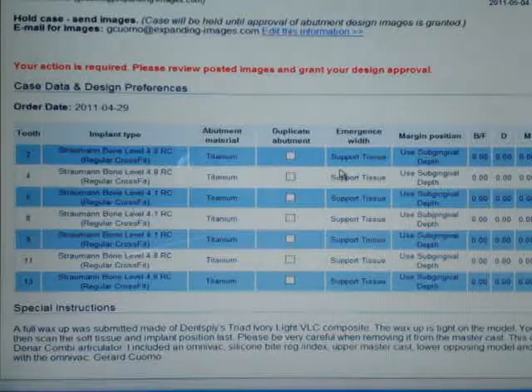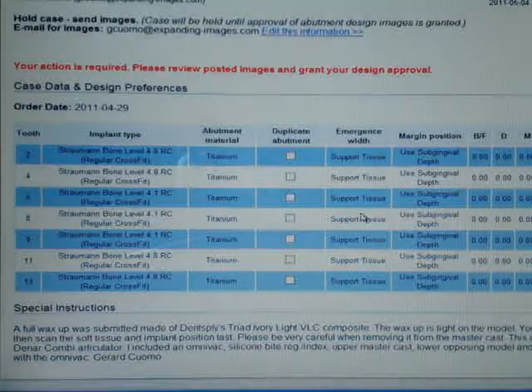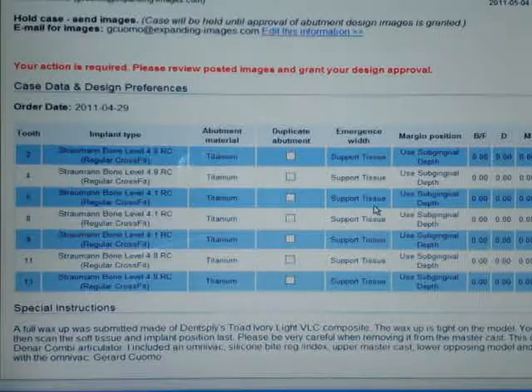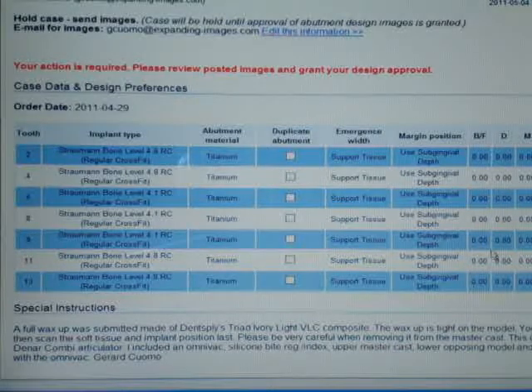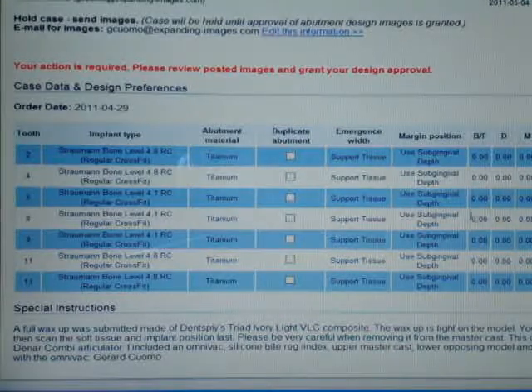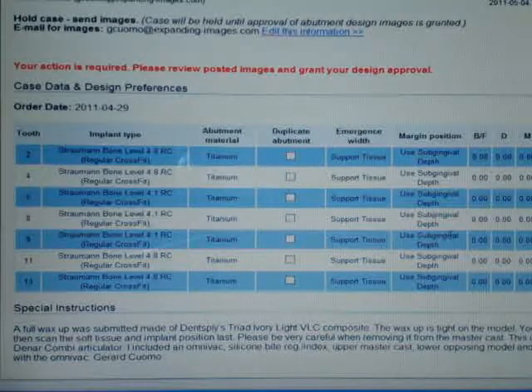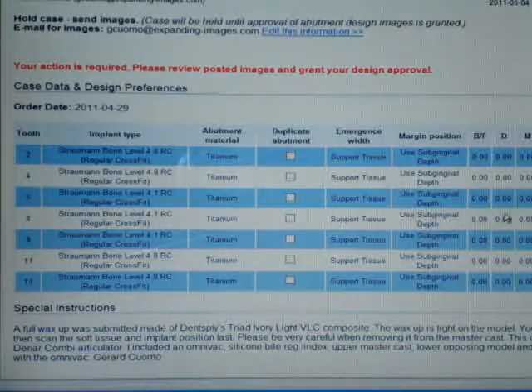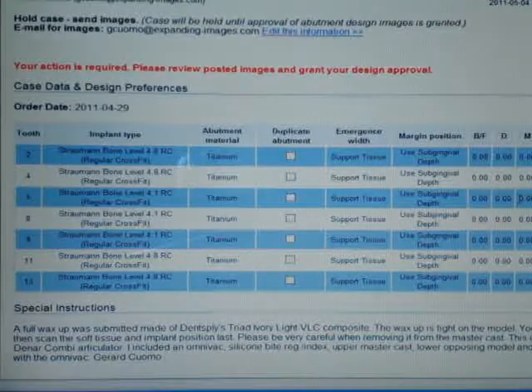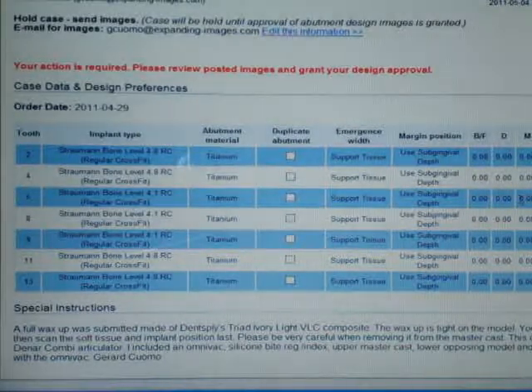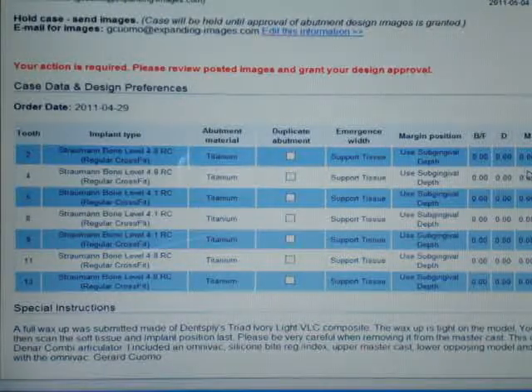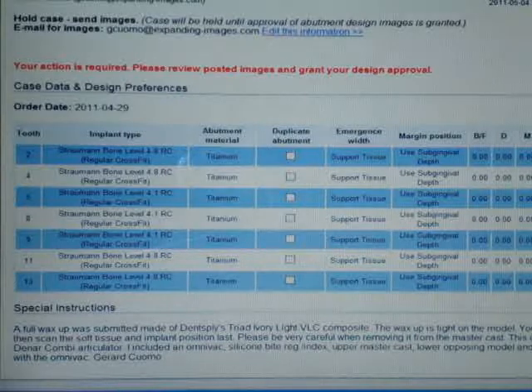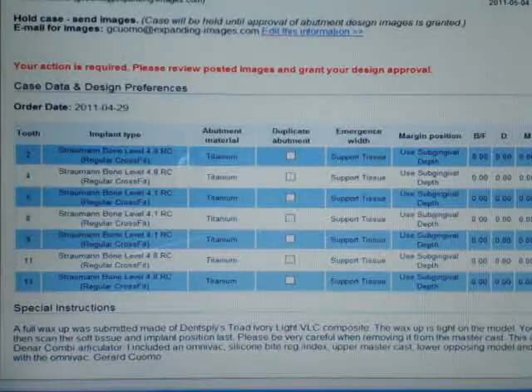In the previous video we went over that and decided to go with supporting the tissue. We wanted the margins as I zeroed them out. I want them right at the crest of the tissue because this is not an aesthetic case. And so having the margins right at tissue level means that's where our cement line will be since this is no longer going to be a screw-retained case. That was our first goal, to shoot for a screw-retained. We couldn't do that.